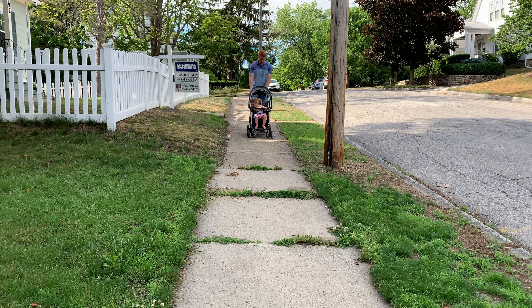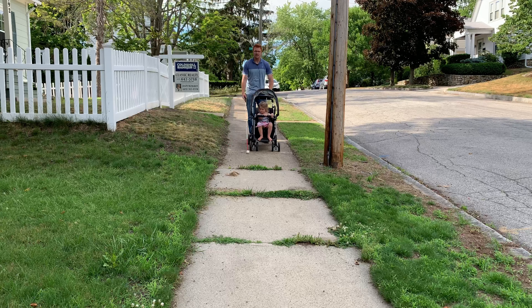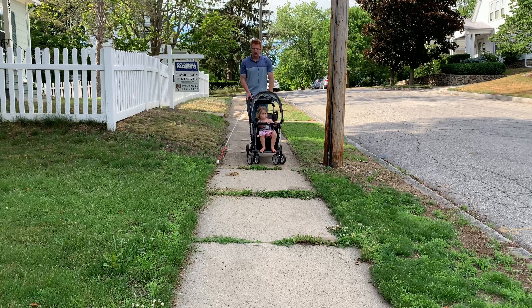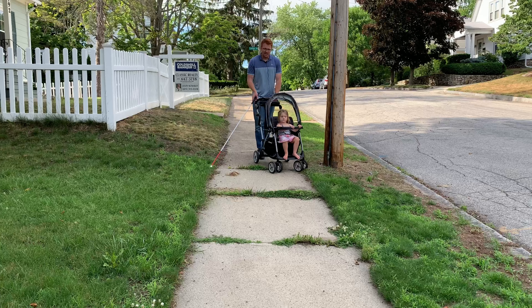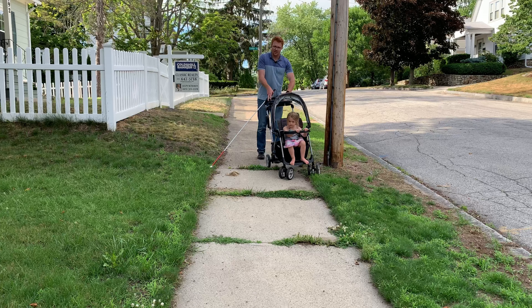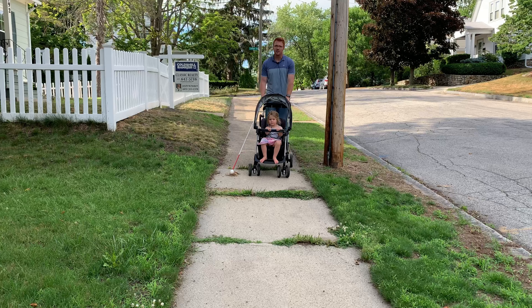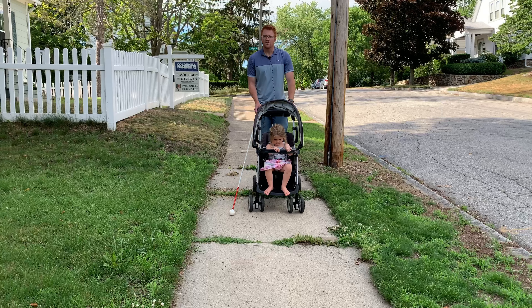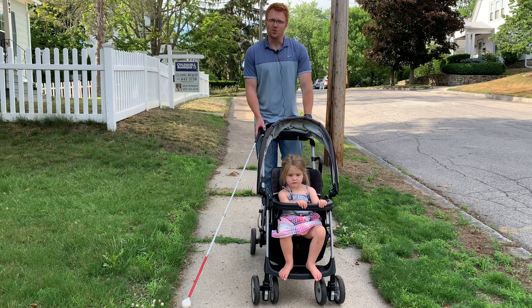When I use and push the stroller, I'm not able to tell when obstacles are coming up because my cane is giving me inadequate warning or feeling. Because it's children and kids, you want to be safe, and it could easily topple if you hit the edge. It could tip to the side, or you go over a hole that the stroller does not feel, and then you trip on it, or there's a crack in the sidewalk. So this is really not the best way to transport either babies or children.